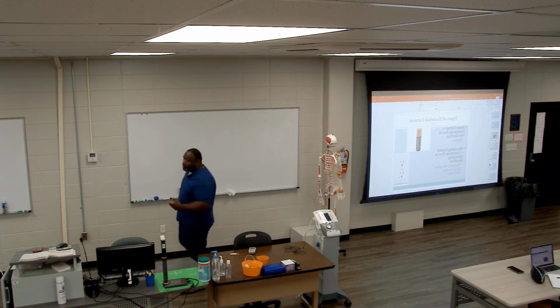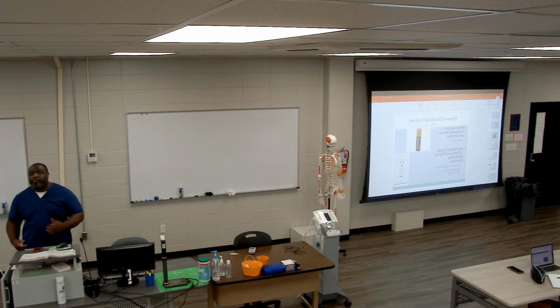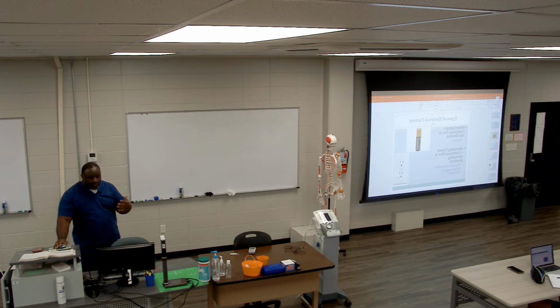The battery-powered devices are going to be stronger, from what most people will tell you, but the book will tell you there's not much difference. But those are the two ways that we're going to get current to a device so that it can get current to a patient.